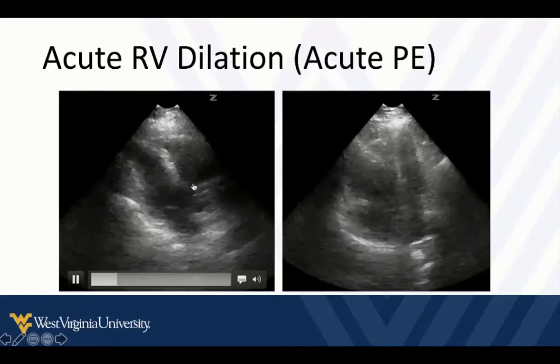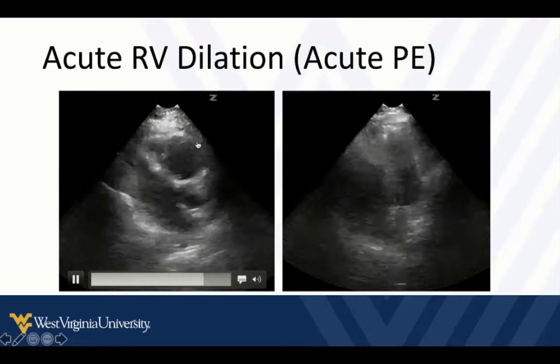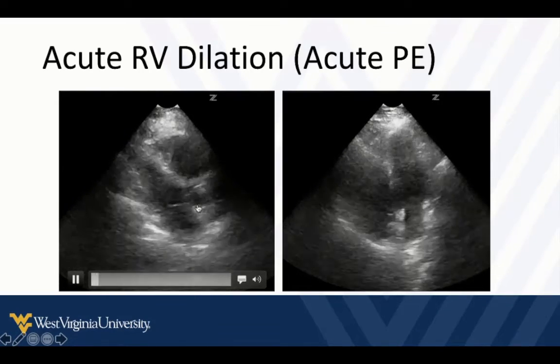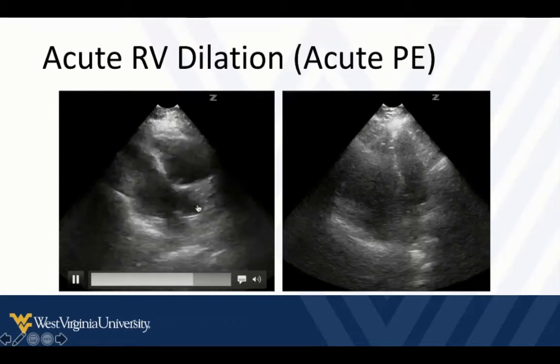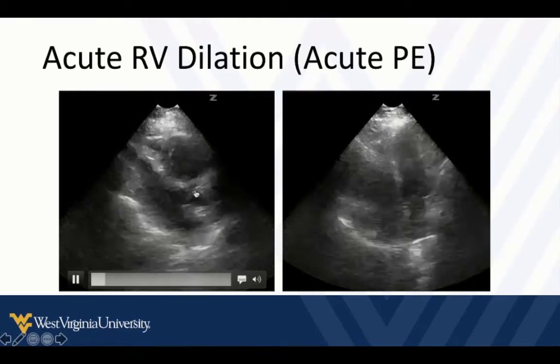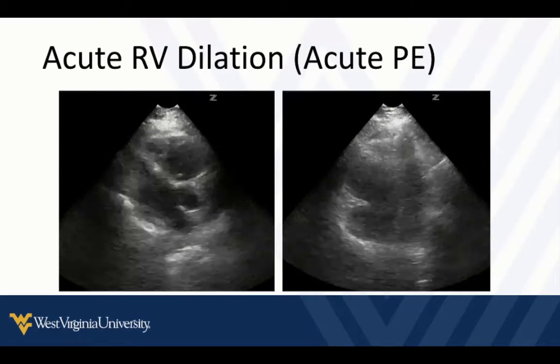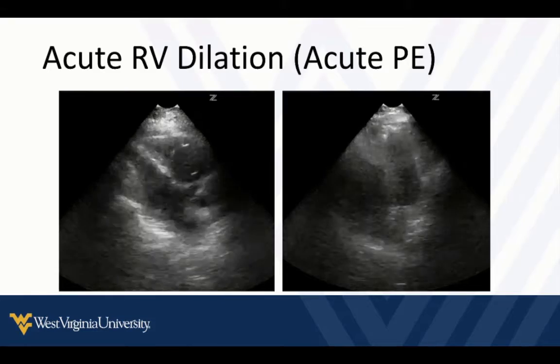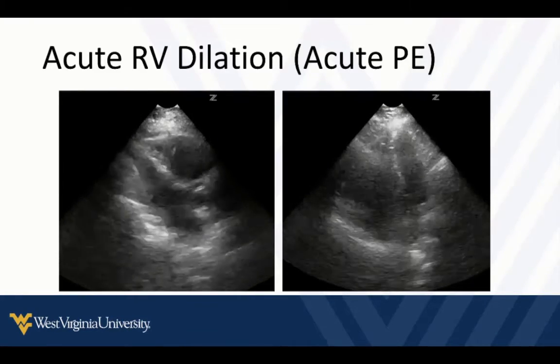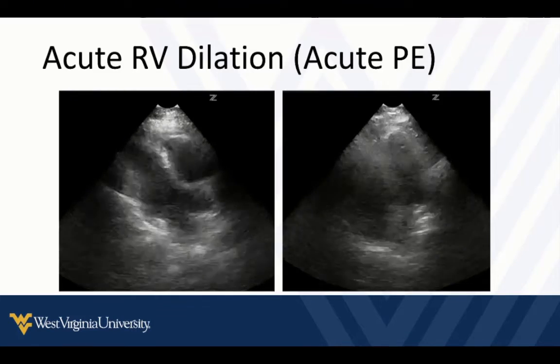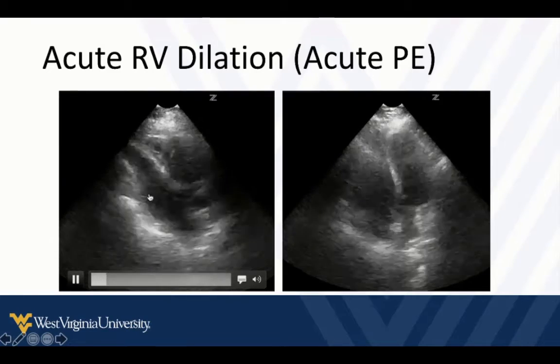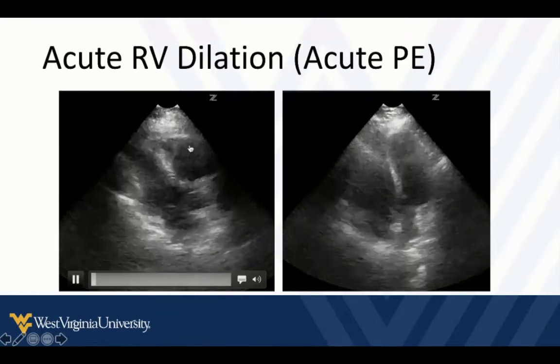In the parasternal long axis view, we see this big massive right ventricle that's compressing the left. To confirm this is a true parasternal long axis view and not a false positive, we should see most of the length of the left ventricle, the mitral valve, and the aortic root. If the probe drifts pointing too much toward the feet, it can bring the right ventricle into view and falsely make it look prominent.